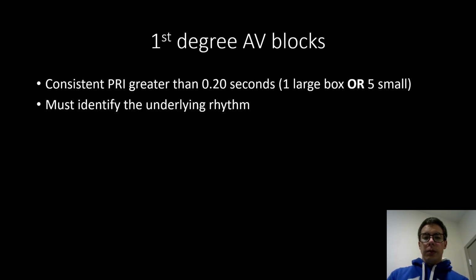So one thing to keep in mind with AV blocks is they're not a rhythm of their own. It's an abnormality within a rhythm, basically. So you still need to identify the underlying rhythm and then identify that there's an AV block.